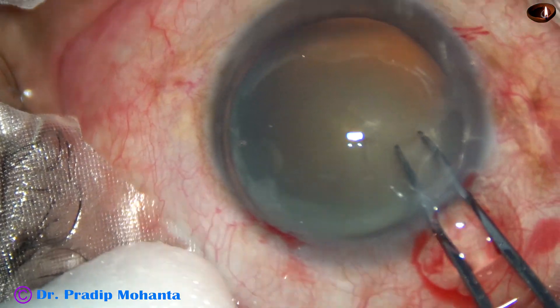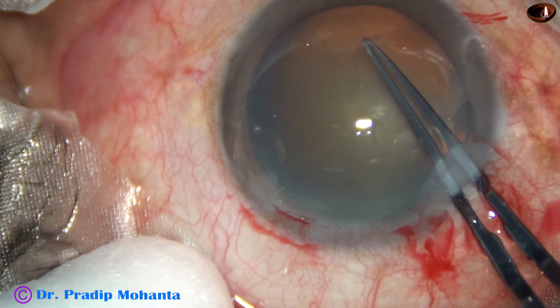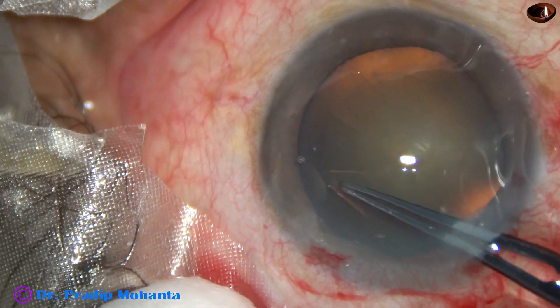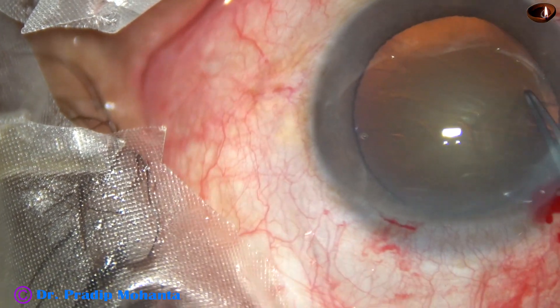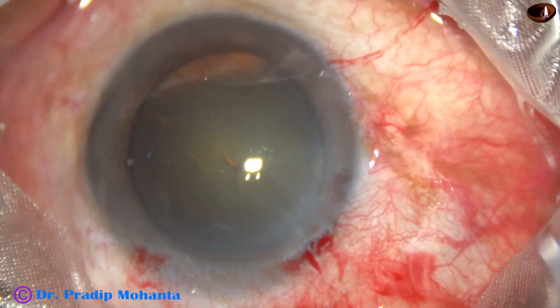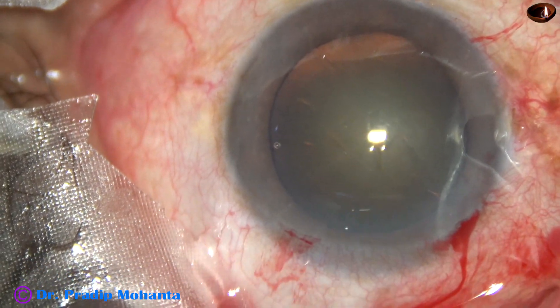The visibility has improved a lot. Now I hold the capsular tag with the Utrata forceps, go anti-clockwise, and complete the continuous curvilinear capsulorhexis. This is an ideal size capsulorhexis of about 5 mm.